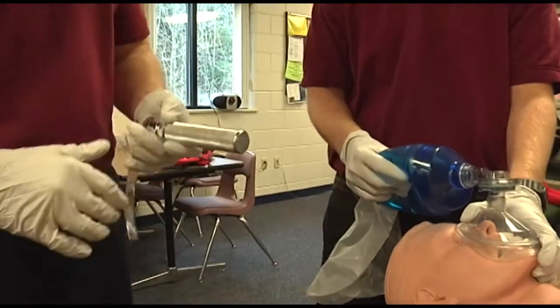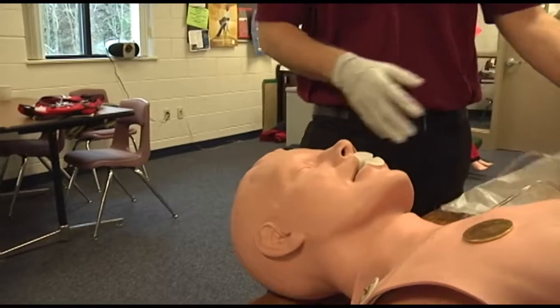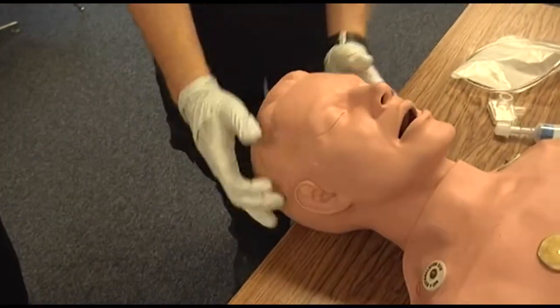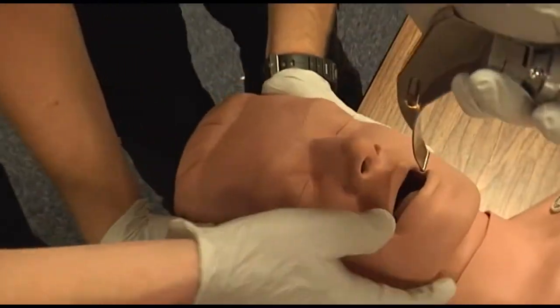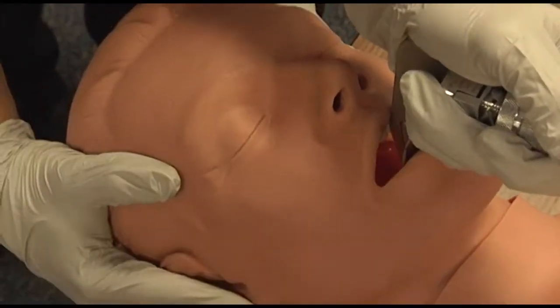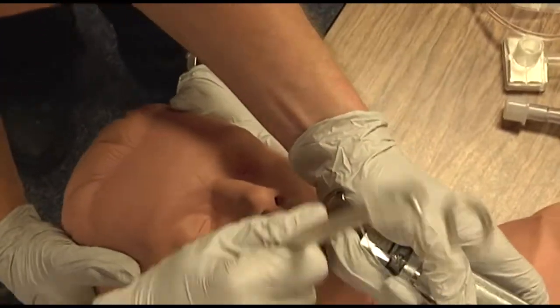When you are ready, your assistant will stop ventilating. Pull out the OPA. Keeping the head in C-spine stabilization, insert the blade while displacing the tongue from right to left. Elevate the mandible with the laryngoscope, then introduce the ET tube and advance it to the proper depth.